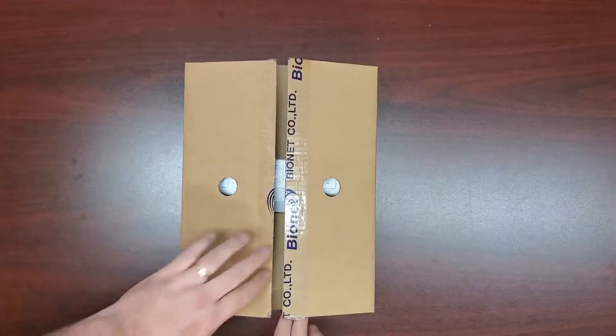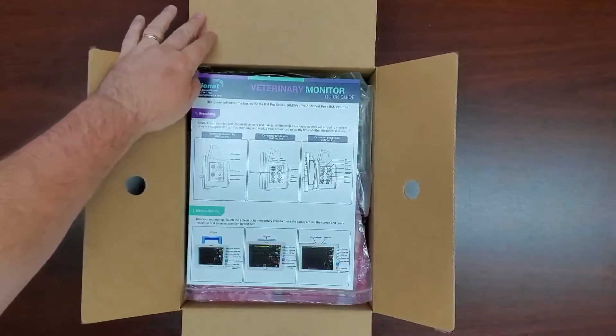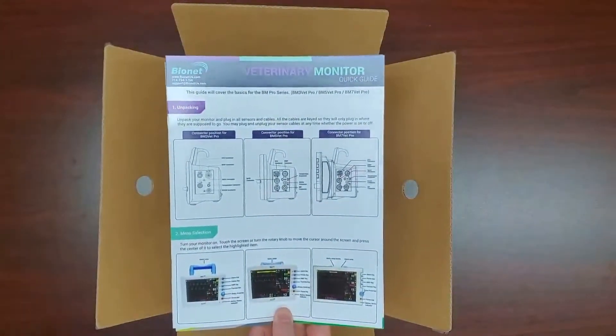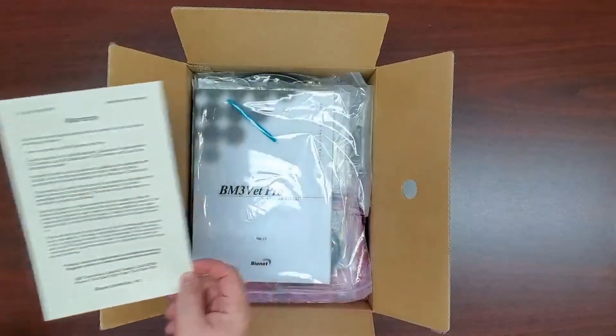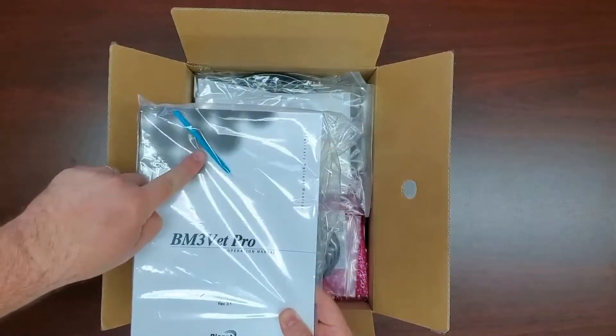Inside the box, you will first find a smaller box with your accessories, guides, and manual inside. You will find a veterinary monitor quick guide that will help answer many of the simple questions you may have about your monitor and how to access its functions. You will also find your warranty card. Next you will find the operation manual and a small plastic stylus pen for the touch screen.